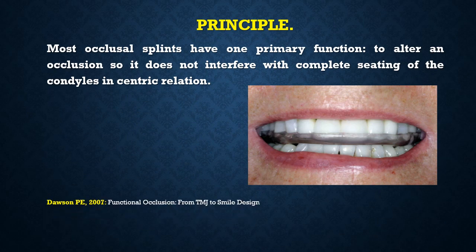Well, the principle of using an occlusal device, according to Dawson: most occlusal splints have one primary function, which is to alter an occlusion so it does not interfere with complete seating of the condyles in centric relation.